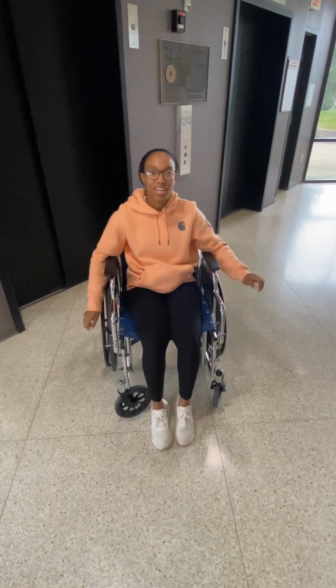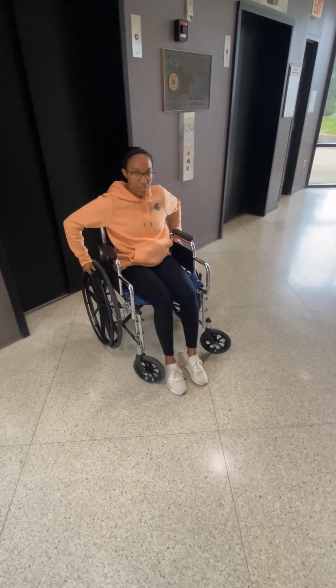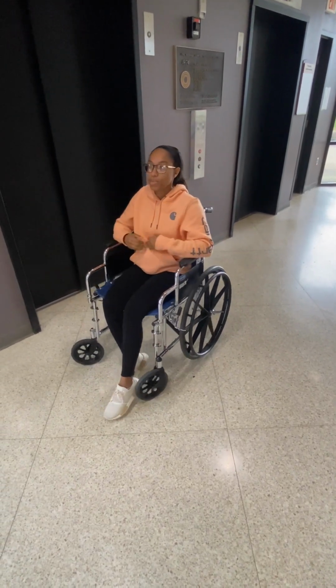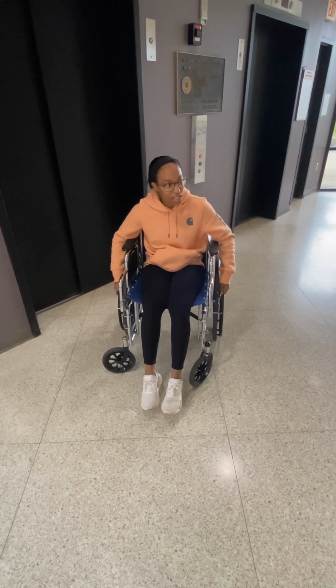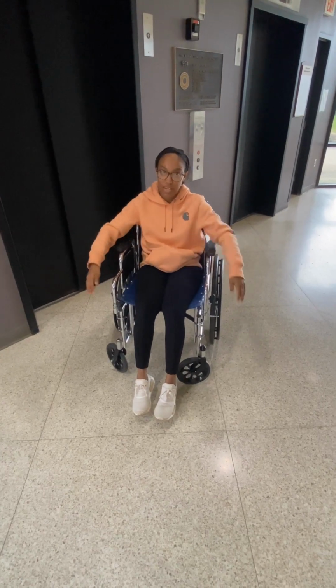So when going in an elevator, it's best to go backwards into an elevator instead of forward, because when you're ready to exit the elevator, you will be able to see out and make sure there's no one in the way when you're ready to leave the elevator.